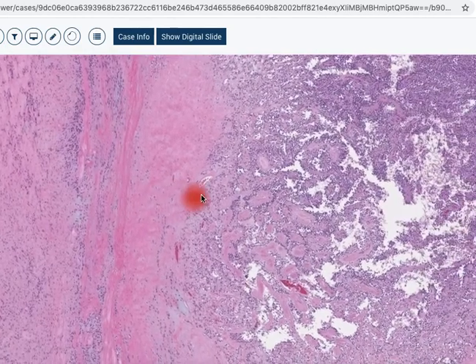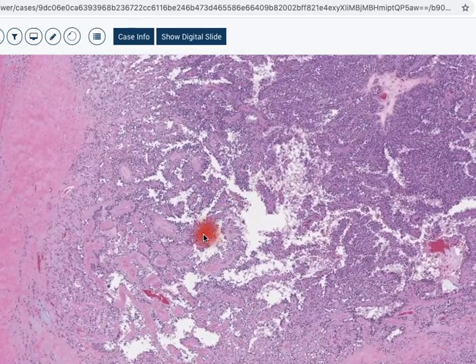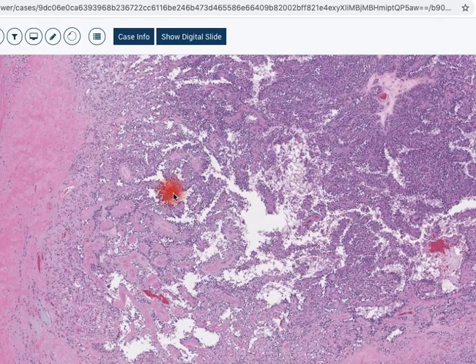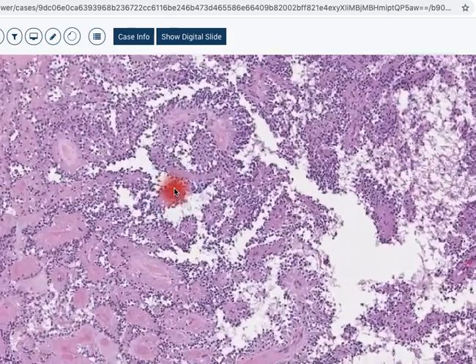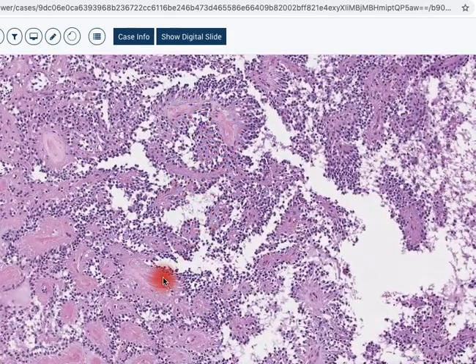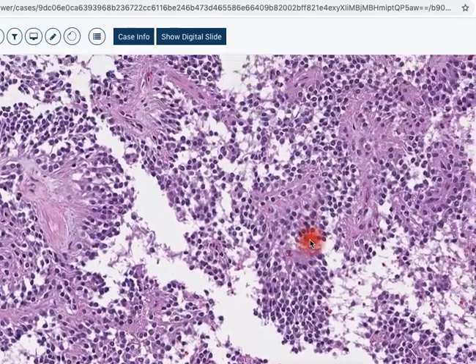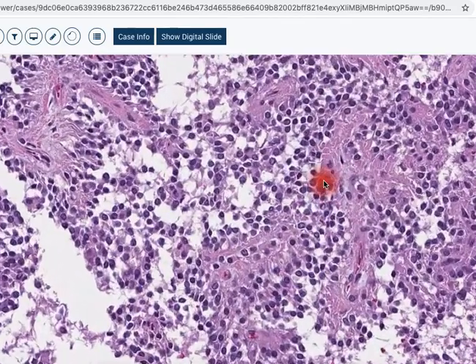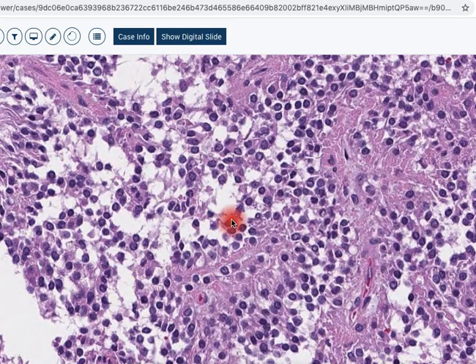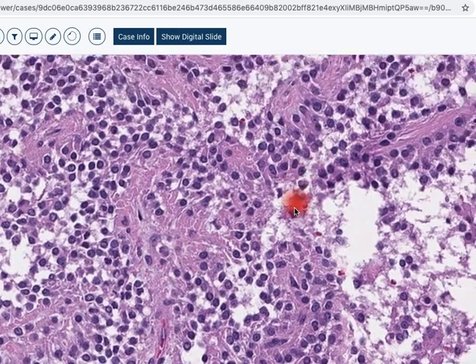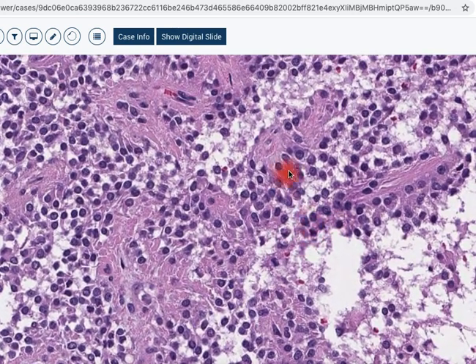Coming over here to this more solid area, we see this sort of papillary-like structures, some sort of central hyalinized, partly vascularized cores, and then this similar pattern of epithelium. Very small nucleoli, fairly bland, not a lot of mitoses — maybe one there. And this characteristic appearance.